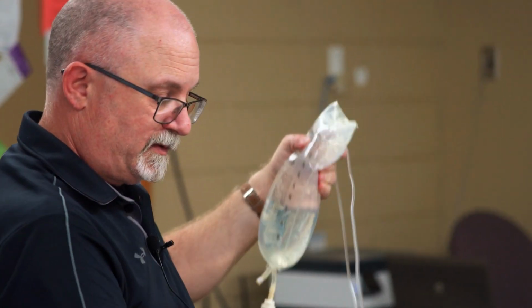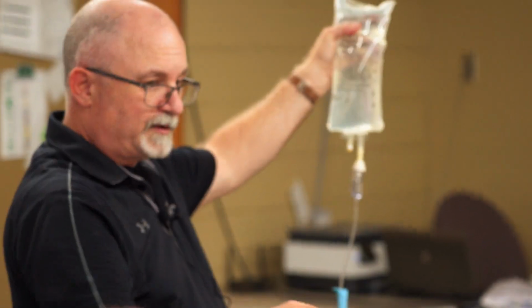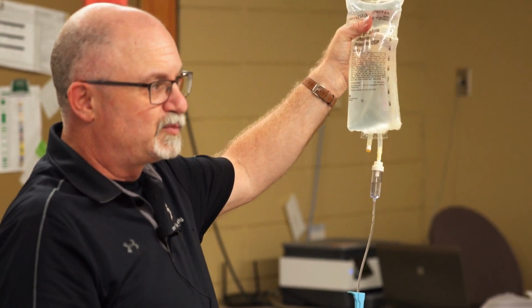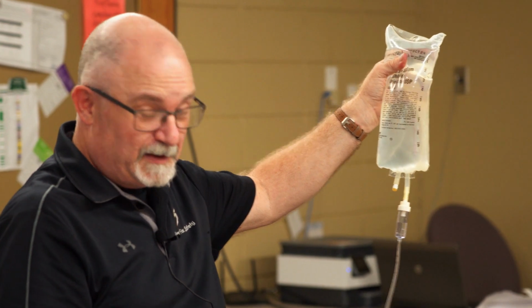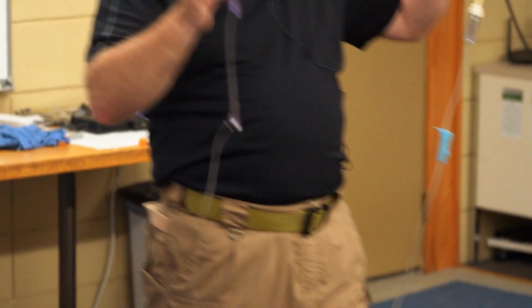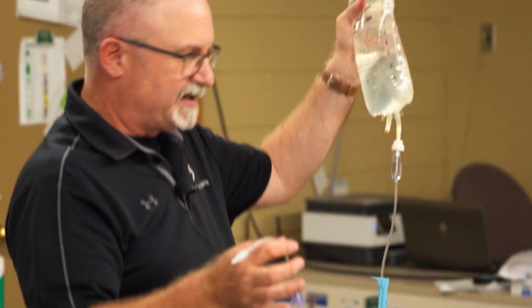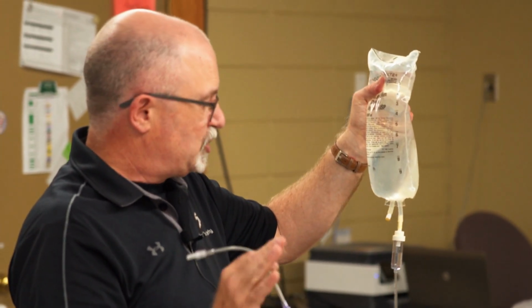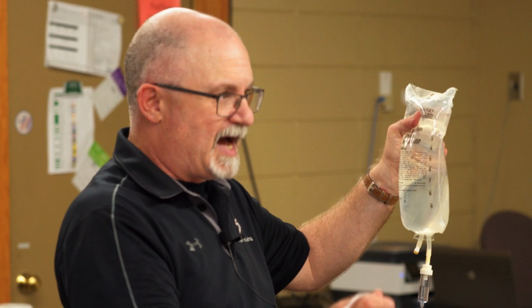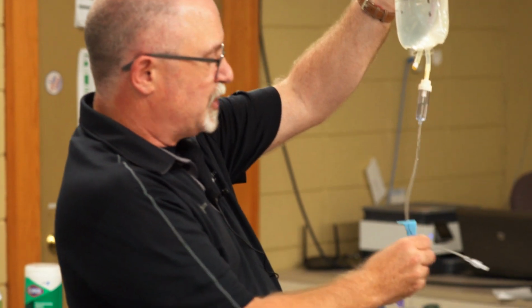All right, well, what's in here right now? What's in the bulk of this air? So what if I hook this up and push all that air into them? Are we going to kill them? No. Probably not. We don't want to do it. Unless they're in really, really bad shape, they'll be fine. Yes, there are things called air embolisms, but this is not enough to do that. So don't do it, but don't jump off a cliff if you do. It's not the end of the world. I don't want you panicking about it, but also make sure you flush the line.